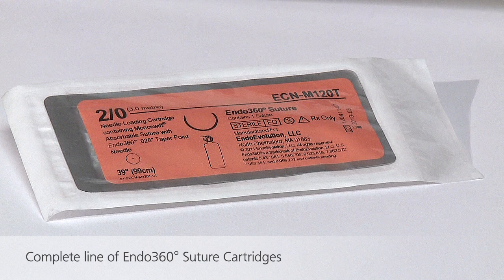Endo360 suture cartridges are available with standard absorbable and non-absorbable braided and monofilament sutures in sizes 0, 2-0, and 3-0.